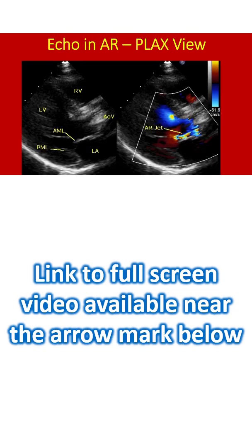This is a parasternal long axis view from another case. The aortic valve is seen as grossly thickened and calcified. The right panel shows the multicolored jet of aortic regurgitation along the ventricular surface of the anterior mitral leaflet. This is quite an eccentric AR jet, and hence assessment of severity will be difficult.